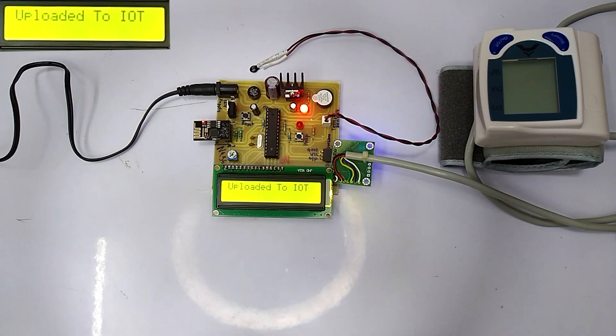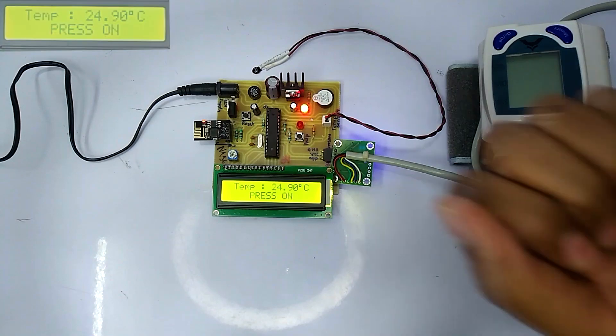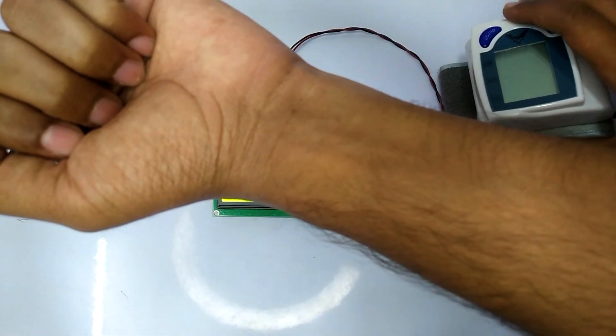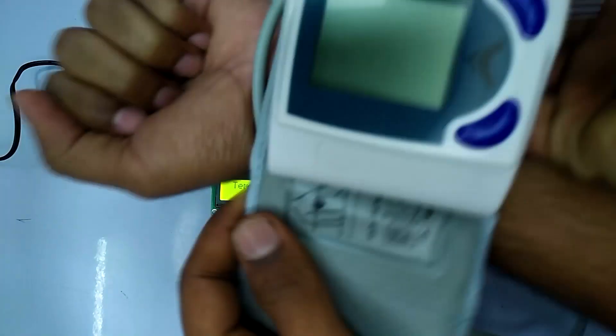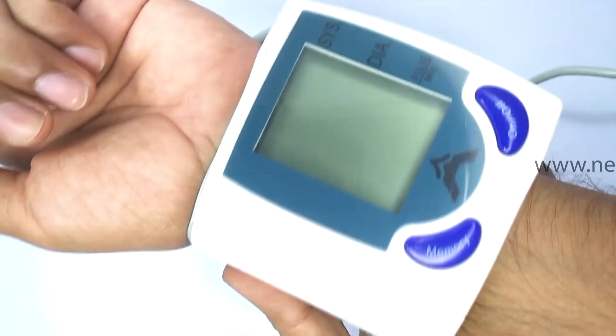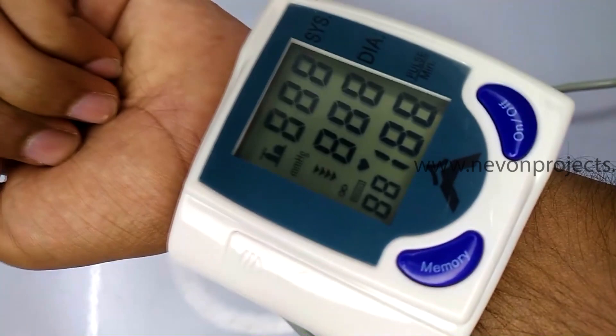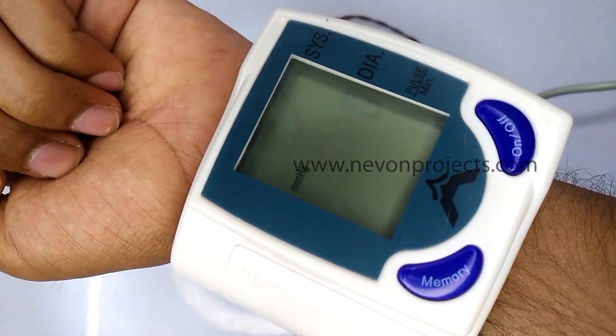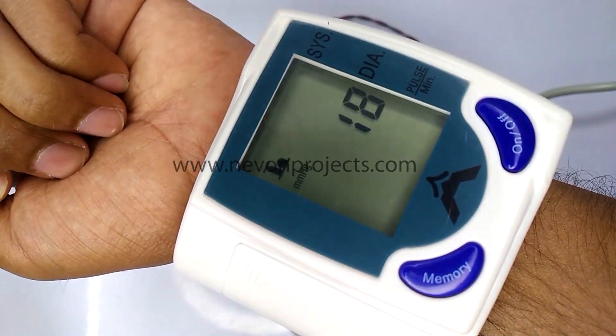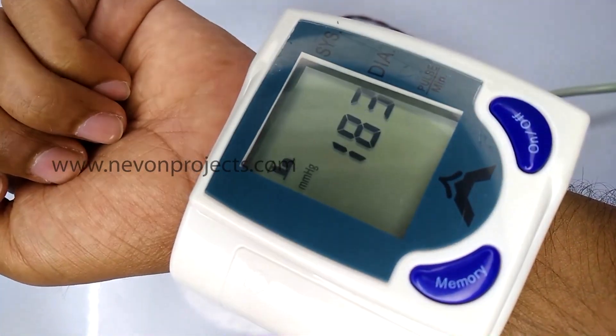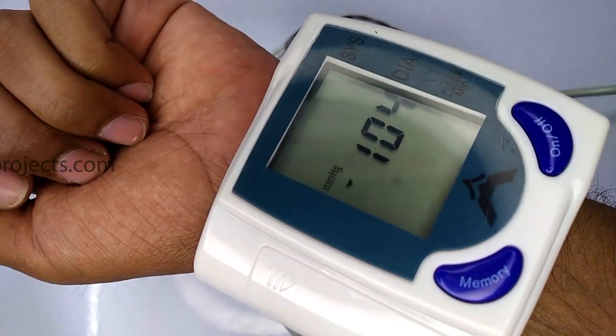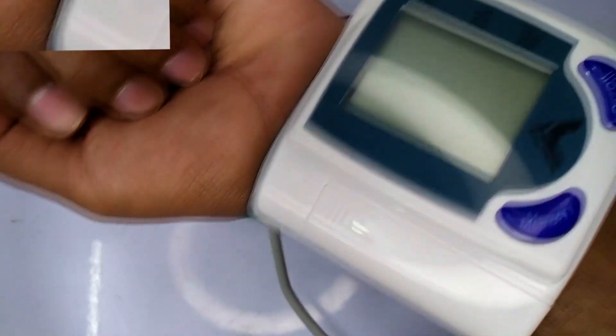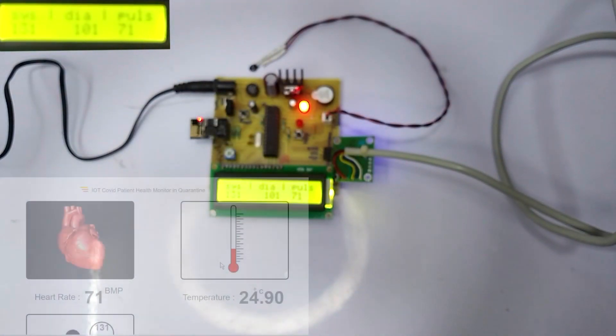The system is connected to the blood pressure and heart rate monitor sensor. All we need to do is attach the blood pressure and heart rate monitor sensor to the patient's wrist, then click on power on. It shows the patient's blood pressure. After displaying blood pressure, it is uploaded on the IoT screen.